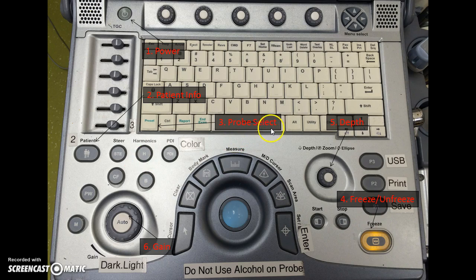The next important button for learners is the probe select button, and that is here. And so what that does, it allows the learner to switch between the different probes that are present on the ultrasound. So if they're looking for an abscess superficially, they can use our more linear probe, or if they're looking for signs of hydronephrosis or a kidney stone, they can use the curvilinear probe.